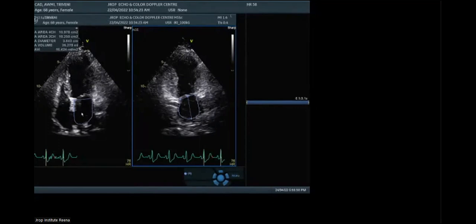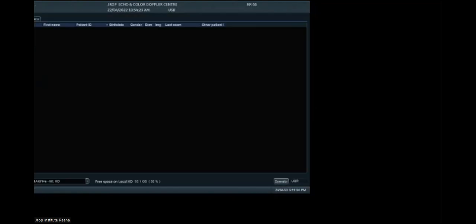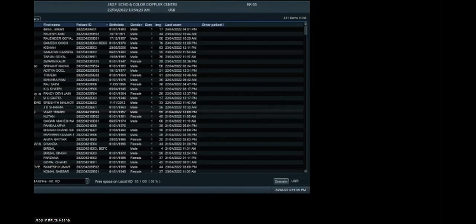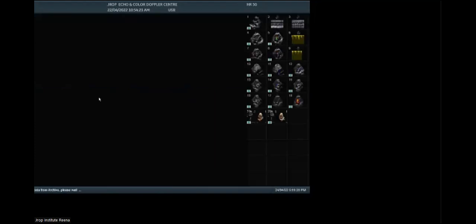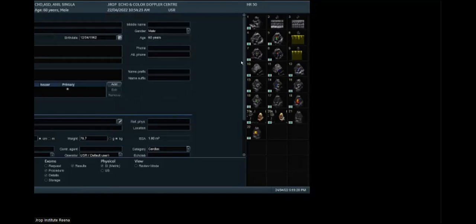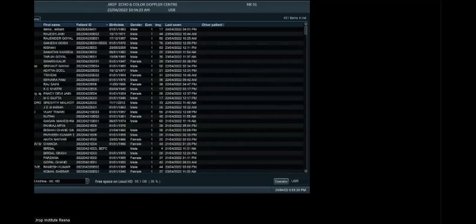Your second question was pulmonic veins. Look, pulmonic veins are very well seen in the pediatric as well as adult population. And how do we see a pulmonic vein? I'm going to show you the pulmonic vein. Give me a second. I'll show it live, that'll be better.